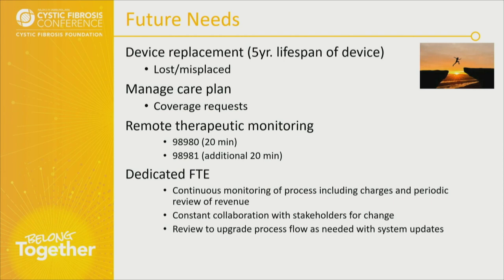You could create an encounter and you could build this. So this is something that we're going to be doing relatively soon and hopefully can share with you next year whether or not that will uptick our revenue opportunity. So there is also another code. This additional 20 minutes is if Dabney calls Laura back in 7 days after she repeats her HS.